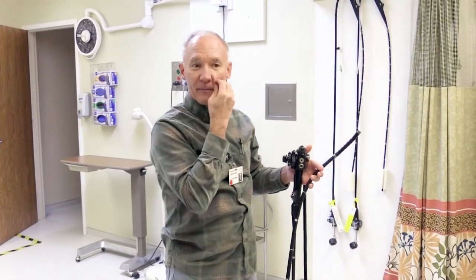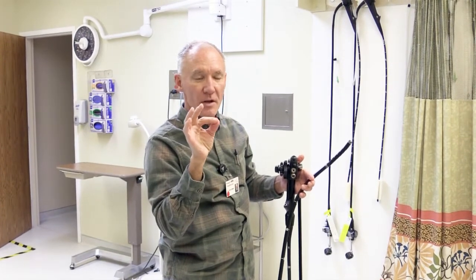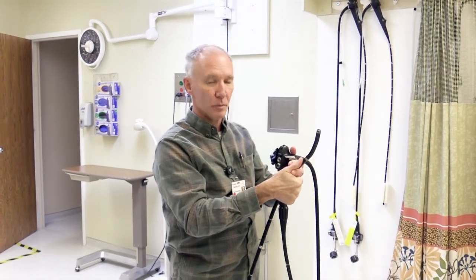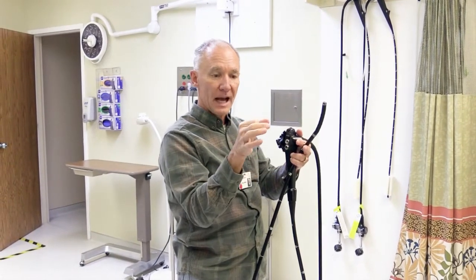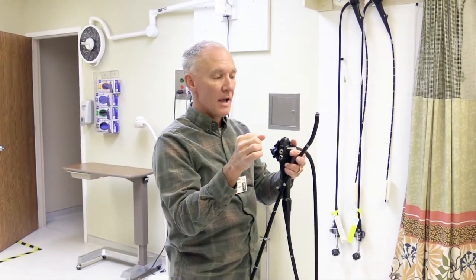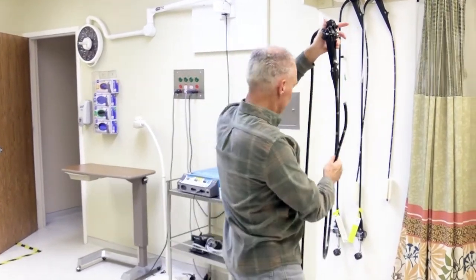And so there's little biopsy forceps that look like little alligator pinchers. And then there's also wire loops, like if you have a polyp, you can put the wire loop around it like a lasso, and then it's hooked to cautery, and as you squeeze the wire loop and tighten it, it burns through the polyp stalk, and it takes the whole thing off, and then we recover it with the suction apparatus. So anyway, this is what the scopes look like.